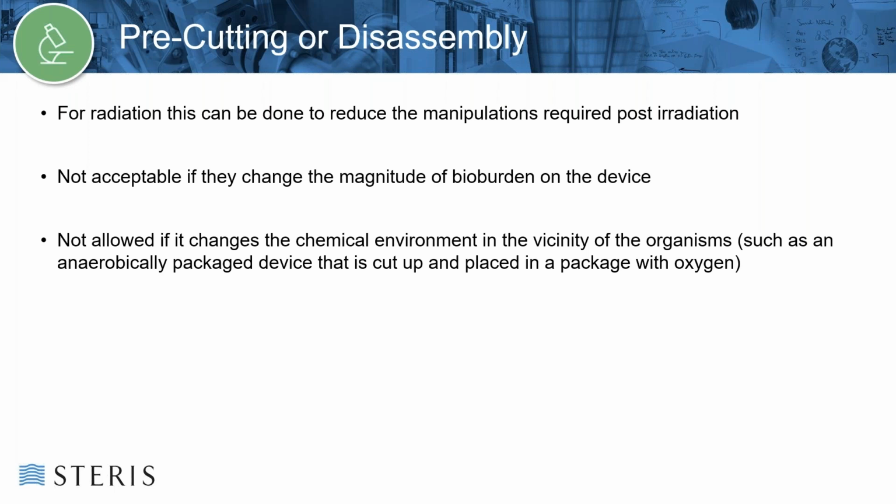It is also not allowed if it changes the chemical environment in the vicinity of the organisms, such as an anaerobically packaged device that is cut up and placed in a package with oxygen. This would no longer be representative of how bioburden would be presented in irradiation for the actual product.